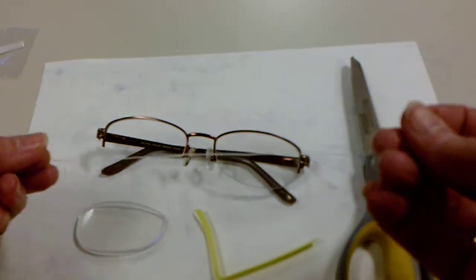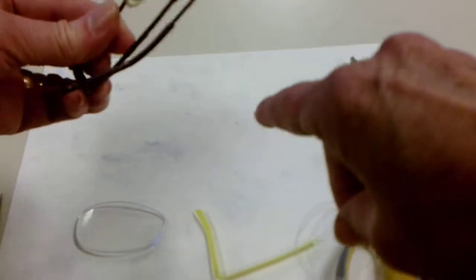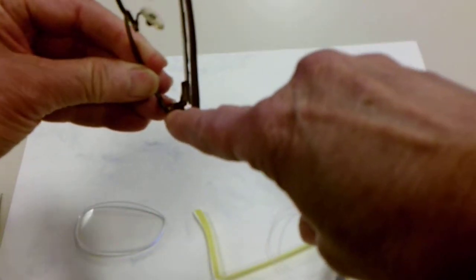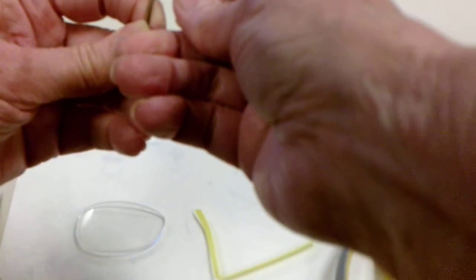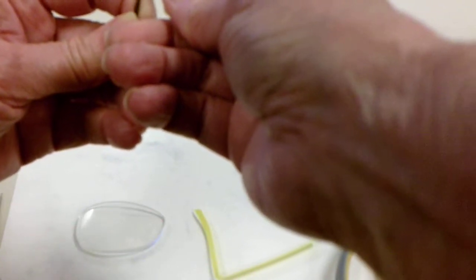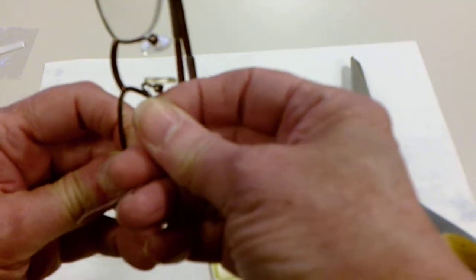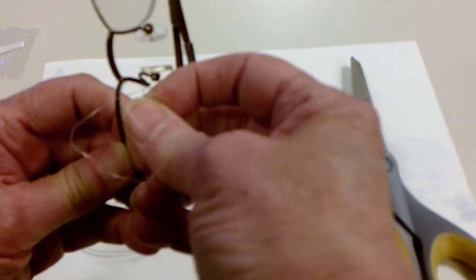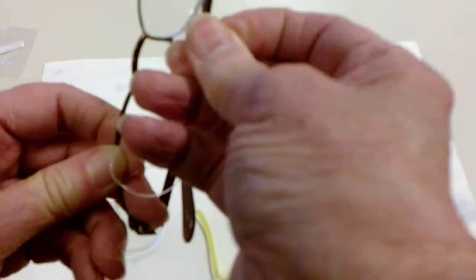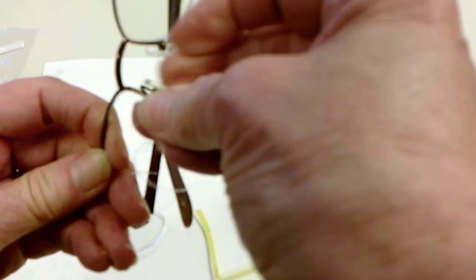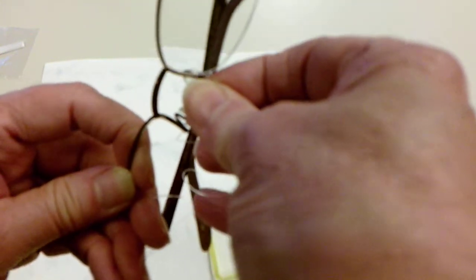We're going to start by looking at the little holes. There's two holes here at the nasal and two holes here at the outside corner. We're going to take our rimless string and thread it through the bottom hole. There we go. And then back through the next hole. This basic lens is held in by tension.